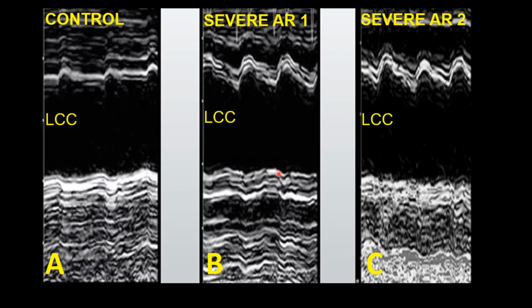So our first patient had 22% distension, and our second patient had a 22% distension. And this seemed very curious. So we have about a 60% pressure change here with a 22% distension, and here we have about a 60% pressure change with a 22% distension, and then a third patient and a fourth patient. So they all seem to have the same values, and we need to explain that.